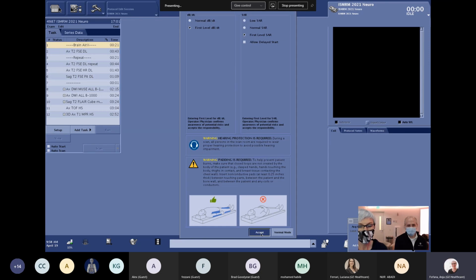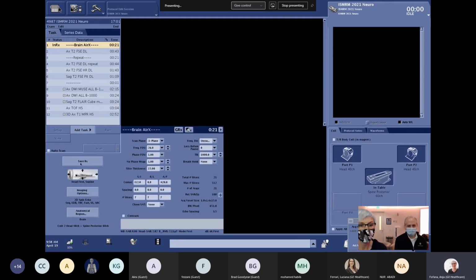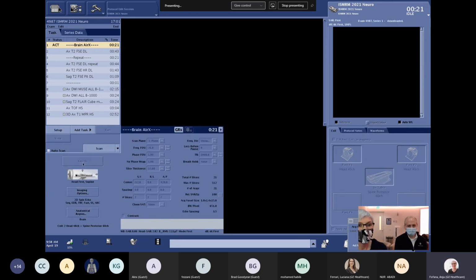So we go back to our first level, start and run a normal 3-plane localizer. And also here you see the first thing showing up automatically, which is our SAR management, our SAR scout. On all of our 3T scanners, we have an automated SAR scan running every single time when we do a brain scan. The scanner knows that we have the brain coil on the table, that we have landmarked in a certain position, and then automatically the SAR scout is kicking in and estimating the SAR for that volunteer with his weight and how he's positioned on the board.